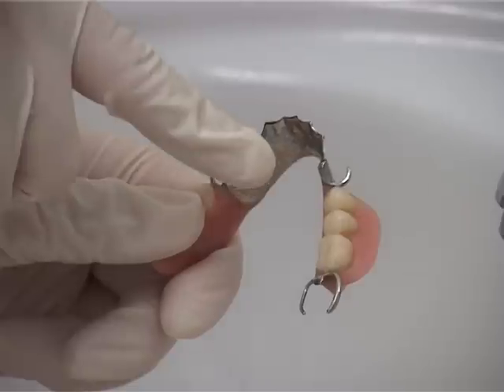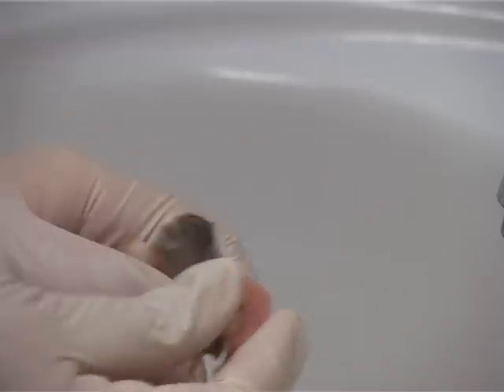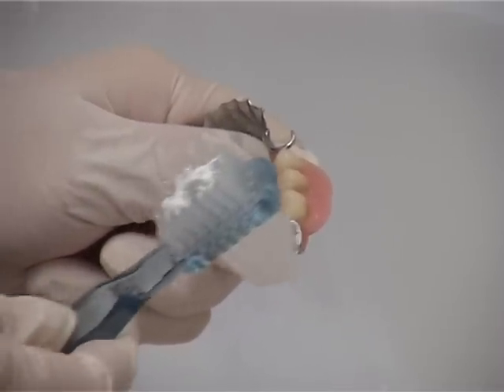Partial dentures have fragile wires that can easily be bent. Don't put any pressure on the wires. Just hold the dentures firmly and carefully clean the wires without applying too much pressure.